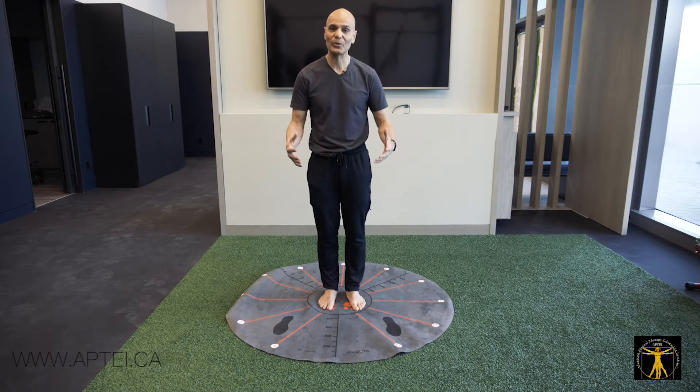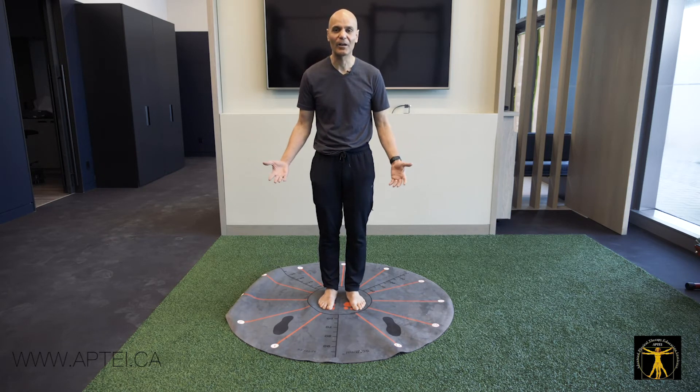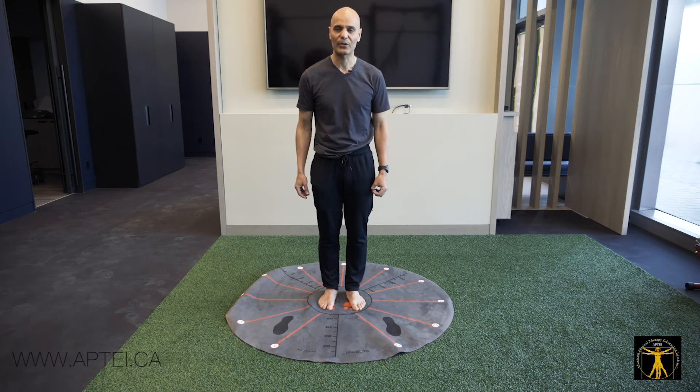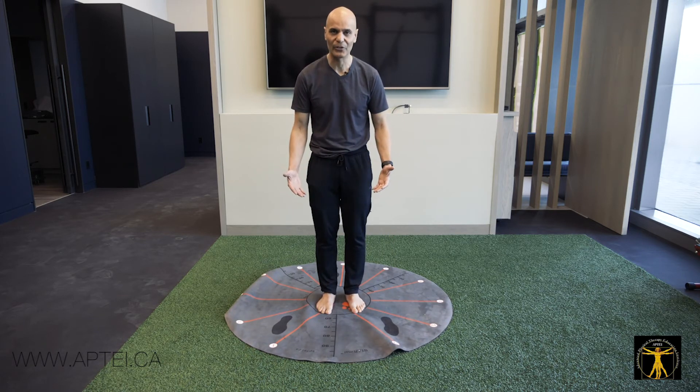It's great for those with Achilles tendinopathies who fear jumping. I simply ask them how it feels. They say it's the same. I say, 'That's great — you just did 12 jumps.' Then I have them close their eyes and repeat counterclockwise, and I ask them how it feels.